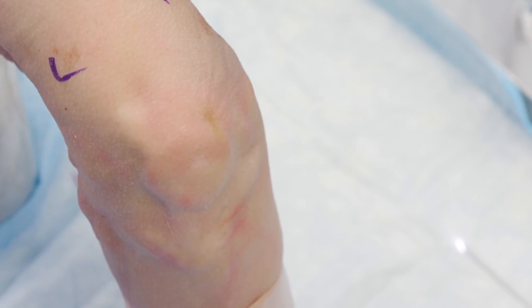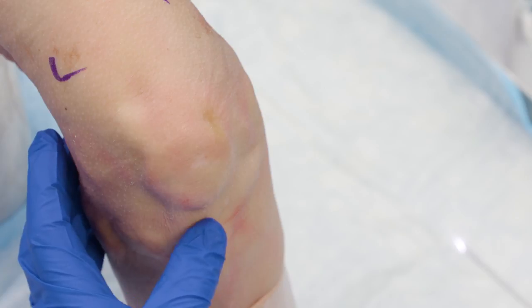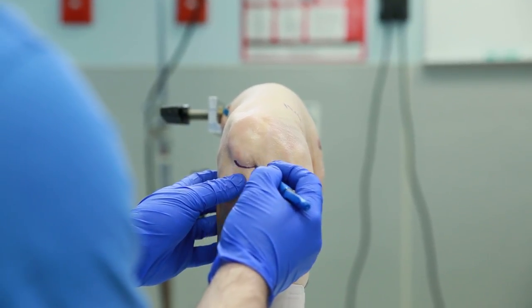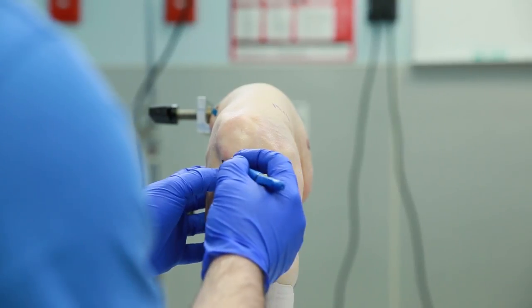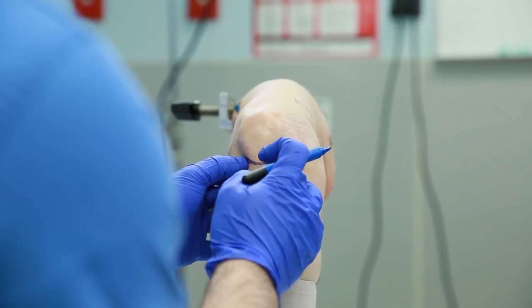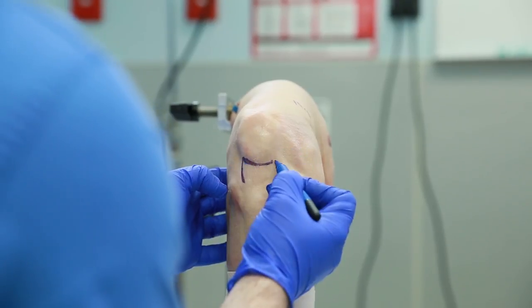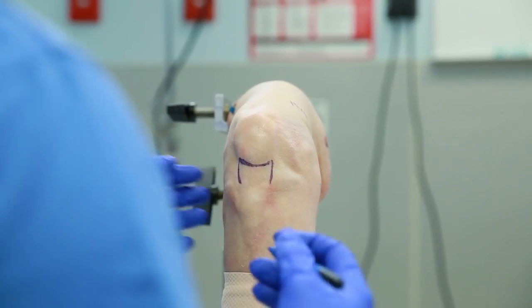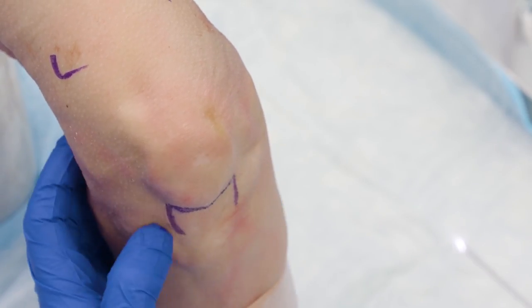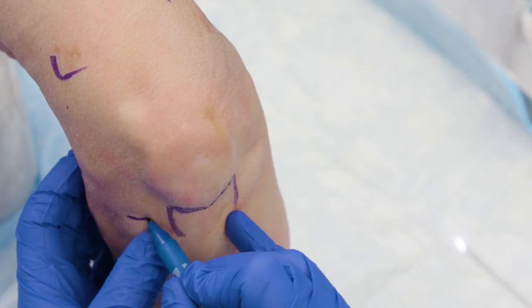When setting the patient up, I'll take a marking pen and mark out my bony landmarks. I'll mark out the inferior portion of my patella, then identify the patella tendon on either side and mark it out, just like in real arthroscopy, so I know where I'm at at all times. I can palpate the tibial plateau and mark out where the menisci might be.